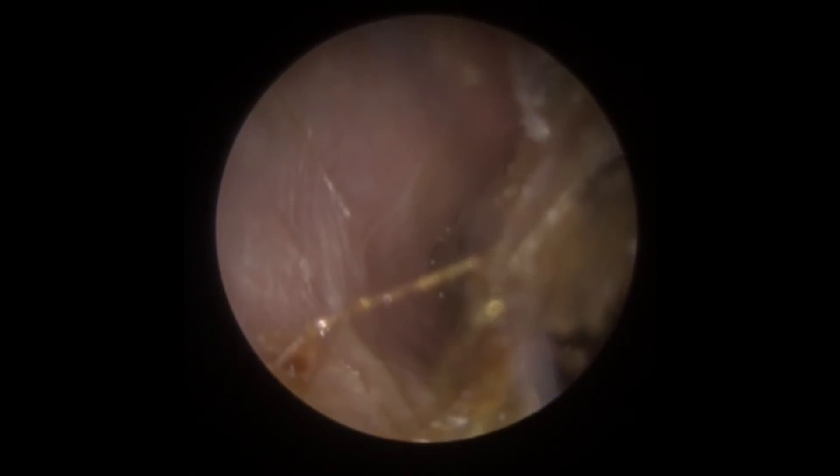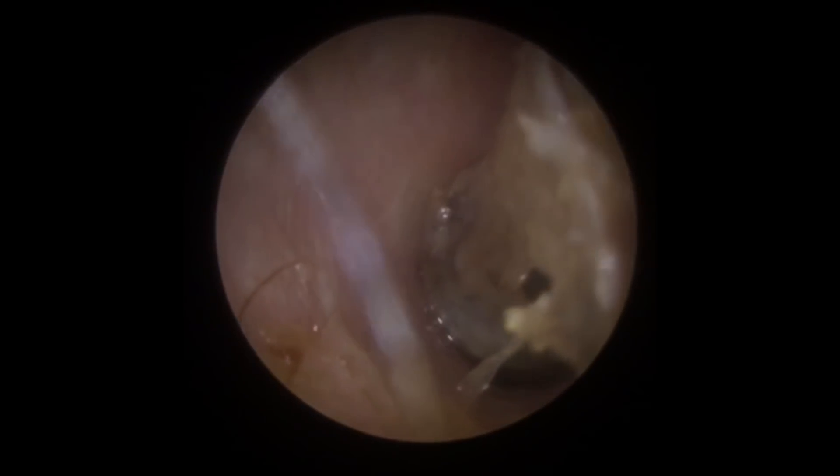What I want you to do is keep an eye on that section of the wax just there as we pull this skin out — watch what happens. As we get the clamp on there we are and we're going to pull — keep an eye on that section. See it pulled that corner of the wax away? It's actually twisted the wax and pulled that one section out, which is going to make our life a lot easier now because we've got rid of the piece that was actually embedded against the side of the canal wall.